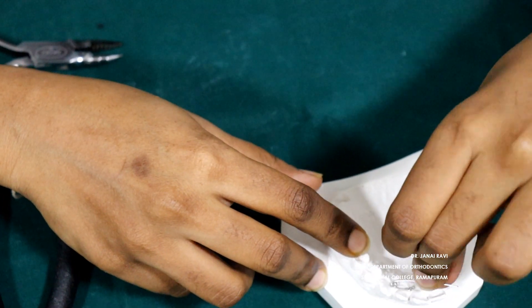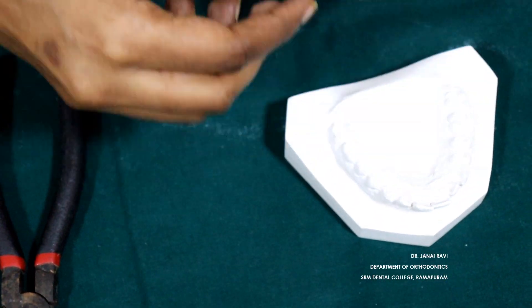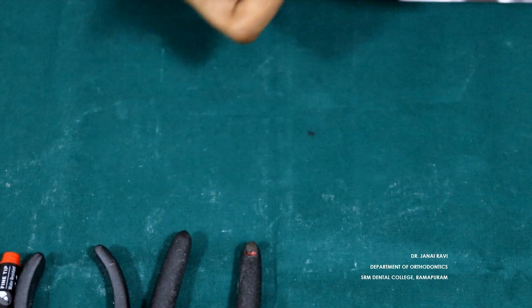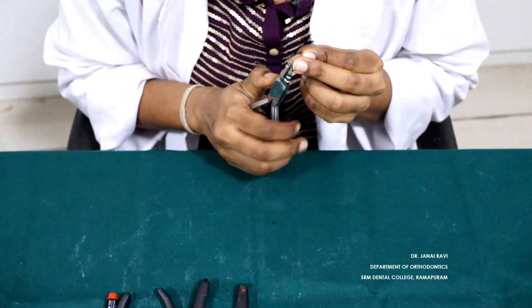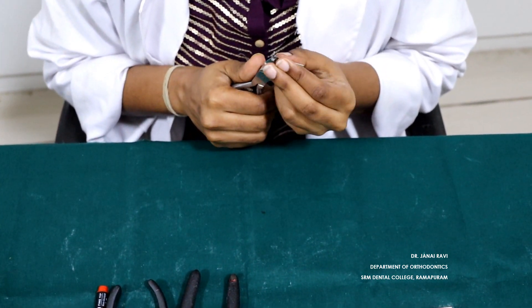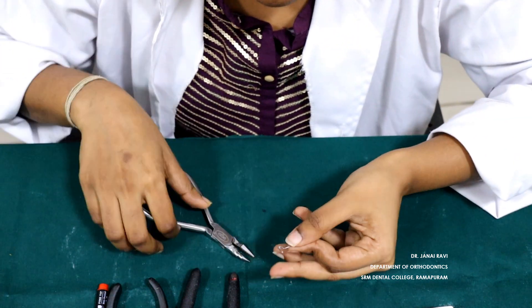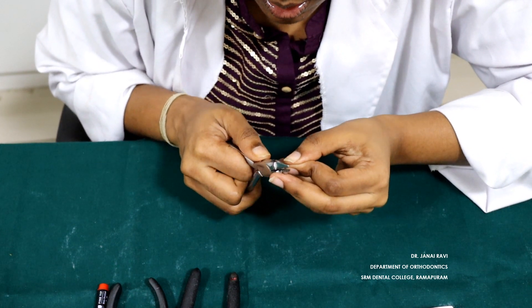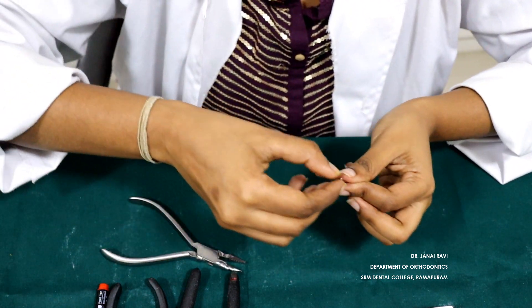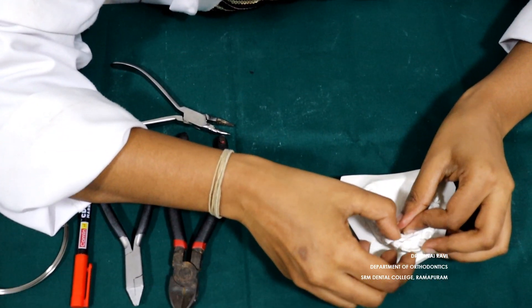This arm will be adapted to the palate. Keep it on the surface of the tooth.